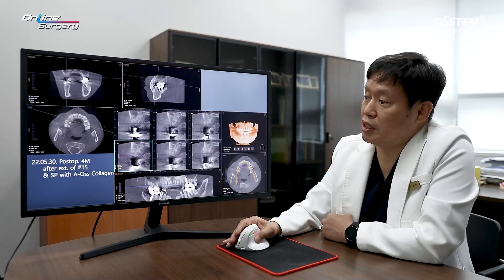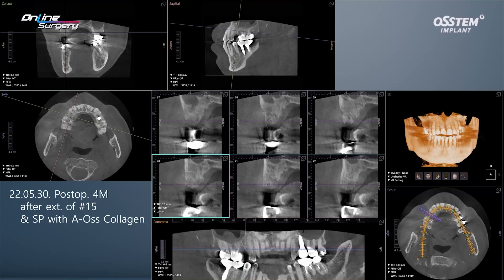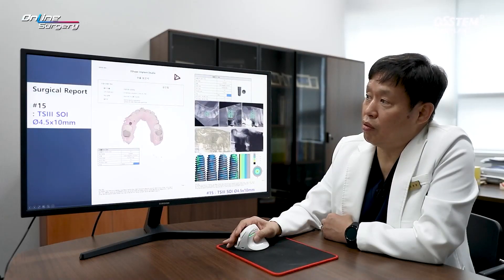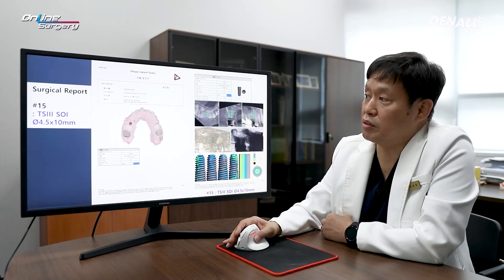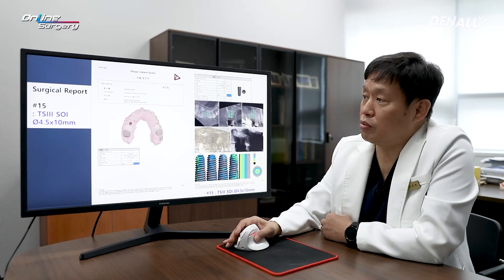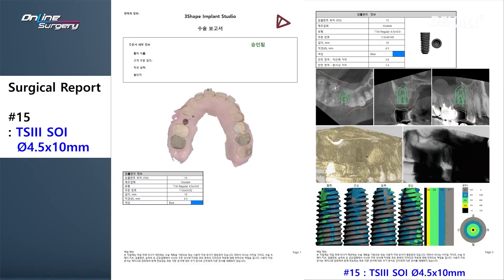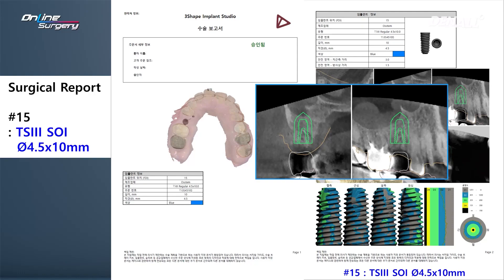After 4 months, in the area where socket preservation was done, the buccal wall was lost significantly, and the palatal wall was destroyed as well. A-OS collagen was used to maintain the ridge. After consulting with the OneGuide team, a TS3 SOI implant was to be used because there was very little buccal wall left. A 4.5 by 10 mm implant was planned. I did not penetrate the sinus floor, but used the cortical bone in the sinus floor to gain stability.